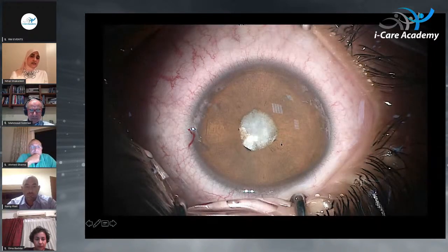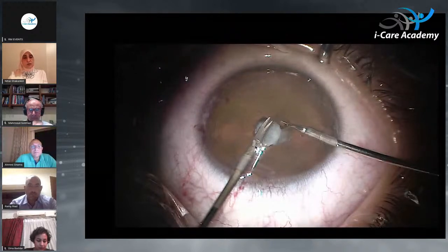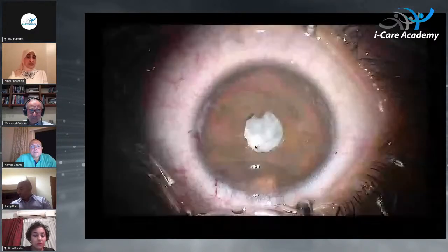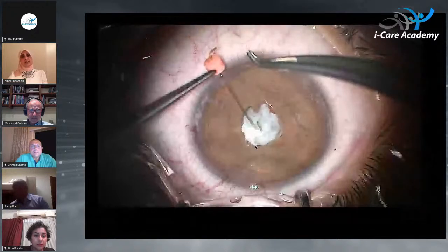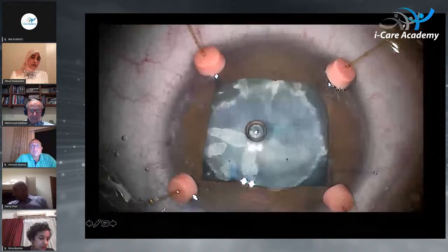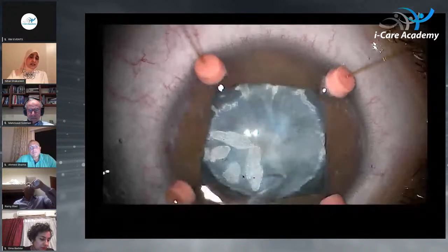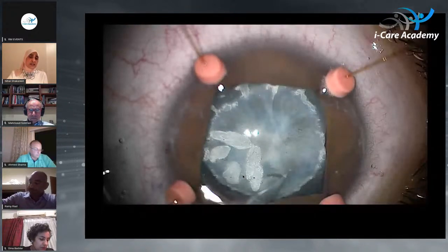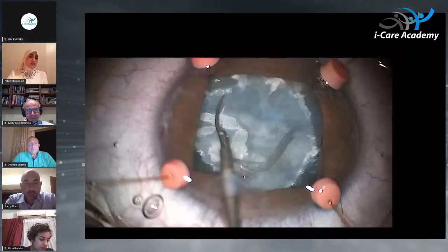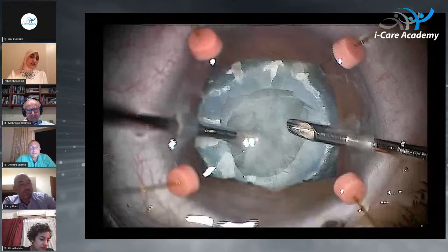This is another eye with band keratopathy and complicated cataract and epilenticular membrane. We hold the epilenticular membrane and cut it with micro scissors. However, again, the pupil is undilatable. We use here again the iris retractors, and there is partial, patchy fibrosis of the anterior capsule, which is very common in cases of complicated cataract. We penetrated with an MVR knife and again with micro scissors to perform a 5 millimeter or 4 millimeter opening. And here irrigation aspiration.